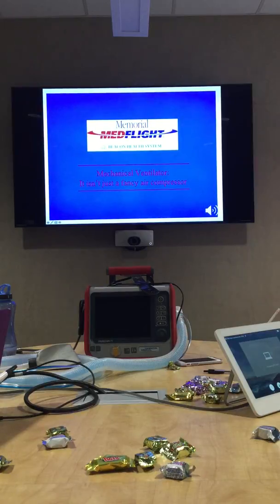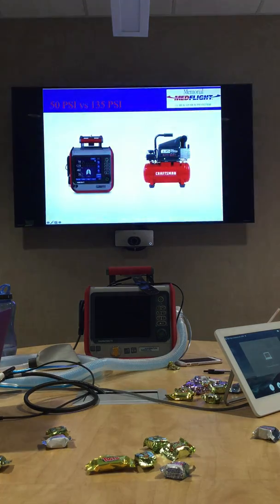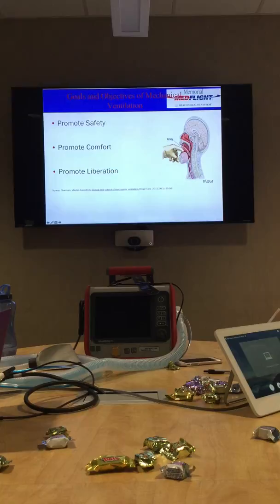PowerPoint, let's hope. So we're going to start with mechanical ventilation, and just that it's basically not just a fancy air compressor. It has a lot less PSI. We're going to talk about the goals and objectives of mechanical ventilation.